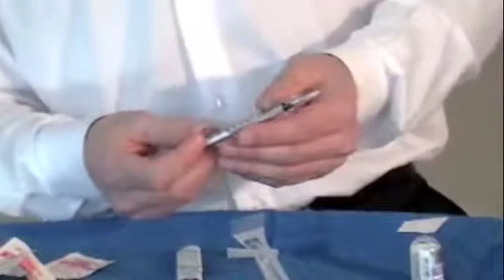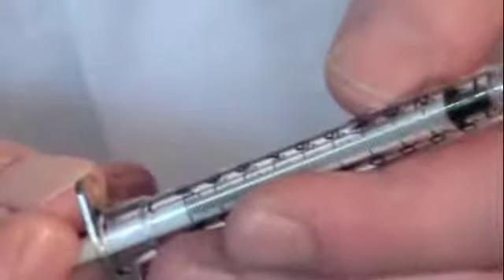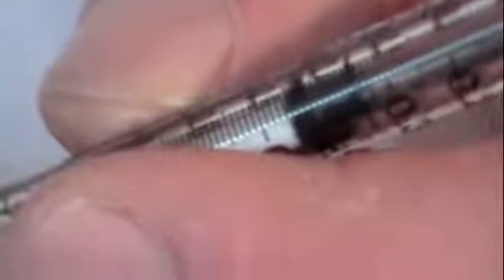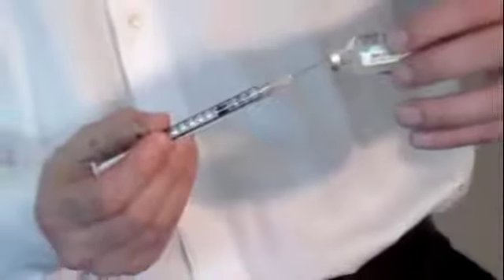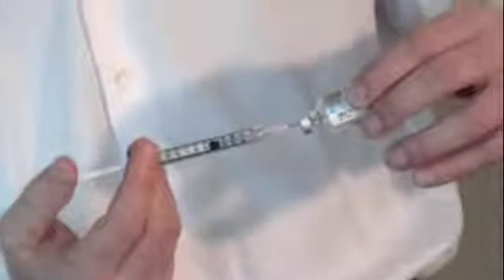Remove the cap of the needle. Verify what your appropriate dosage is. In this case, we will assume it's 0.35 mLs or 0.35 cc's of testosterone cypionate. This is a fairly typical dose. You're going to want to aspirate air into the syringe up to the 0.35 cc mark. We're going to then inject the air into the testosterone bottle. This makes it easy to withdraw the medicine.